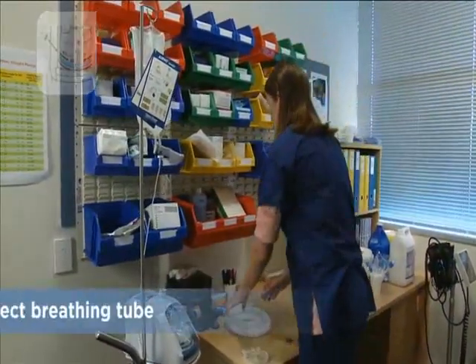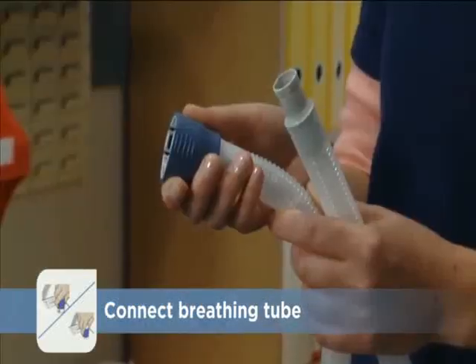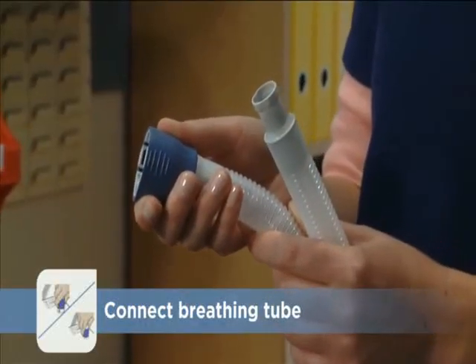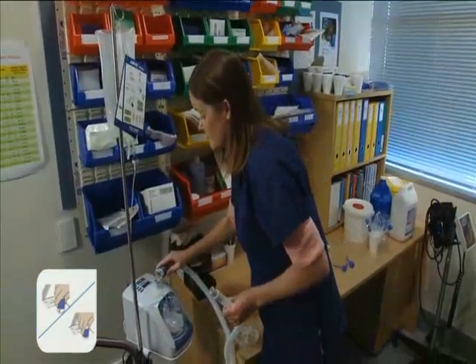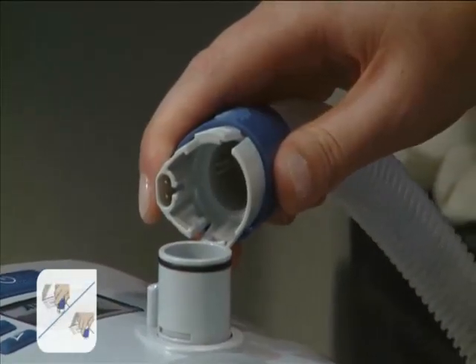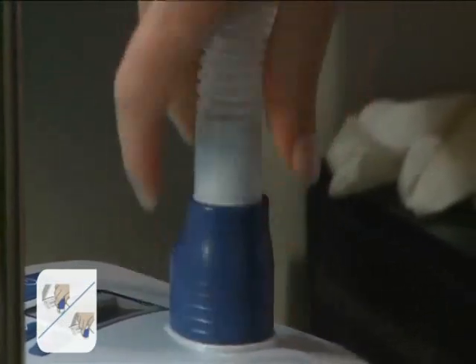Now connect the heated breathing tube. The end with the blue sleeve attaches to the Evo. Slide the sleeve back and line up the connector with the port on the top of the Evo. Push the connector on and slide the sleeve down to lock the breathing tube into place.